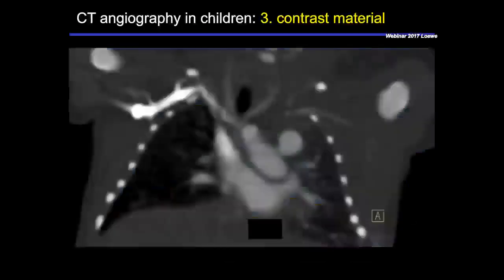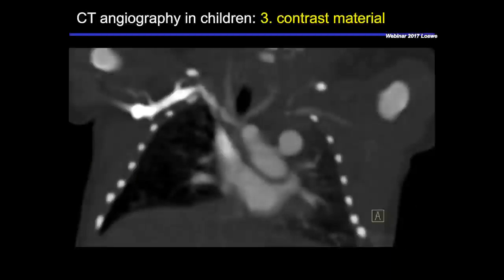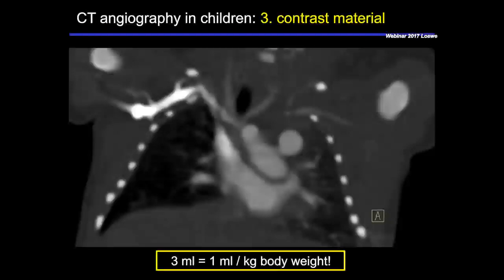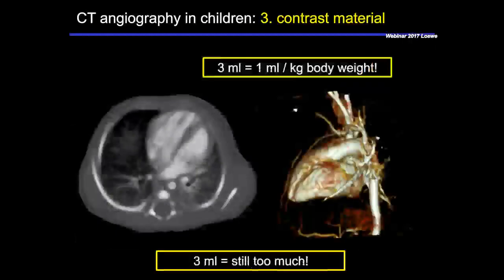Let me show you one example of a very small kid. You see that we have a perfect attenuation of the vascular structures, but we still have too much contrast within the brachiocephalic and the right subclavian vein. The total amount of contrast was just 3 ml. Anyhow, about 50% of the contrast is still stuck in the vein, but we have a very good contrast. So maybe we can even further reduce the total amount of contrast, because the very small children with low dose and low kV protocols really need very small amounts of iodine to end up with almost perfect contrast enhancement. Here, just 3 ml of contrast for this entire examination.